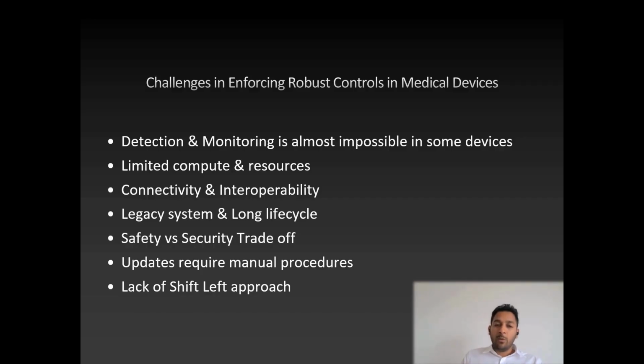There is also a lack of a shift left approach. Some devices just apply security on top, seeing security as a checklist instead of following a shift left approach. They need to integrate security into their software development lifecycle by doing proper design and threat modeling to reduce the attack surface.